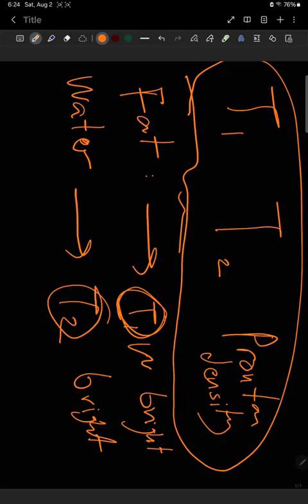So eventually what we could say before we finish this video: MRI is based on nuclear magnetic resonance. It actually also detects the behavior of protons in water and fats. Also, the contrast is biological in MRI, not physical like X-ray.